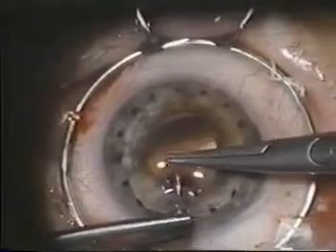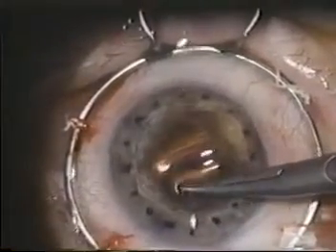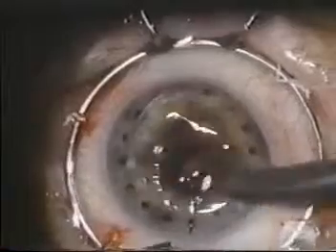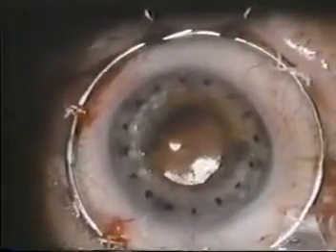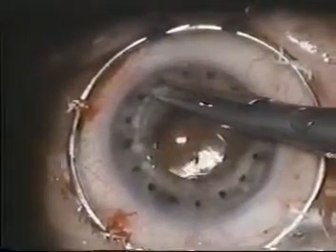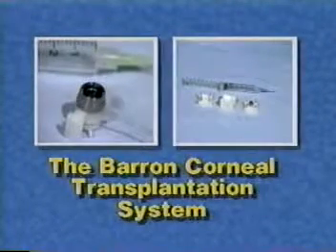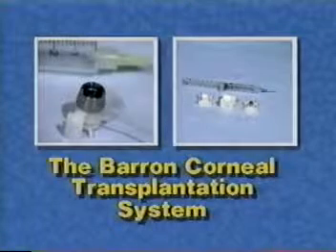Today the goal of a surgeon transplanting a cornea goes beyond simply making a clear graft. Successful surgery should result in a clear graft with no astigmatism. To accomplish this, the surgeon must accurately cut both the recipient and donor corneas and make sure sutures are evenly placed. All of this can now be done with precision using only two disposable instruments.